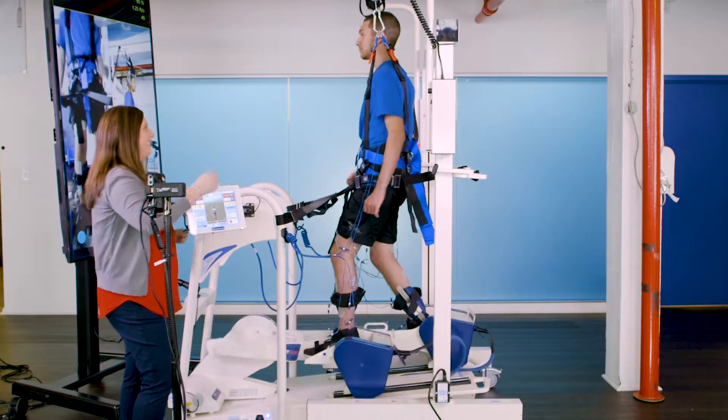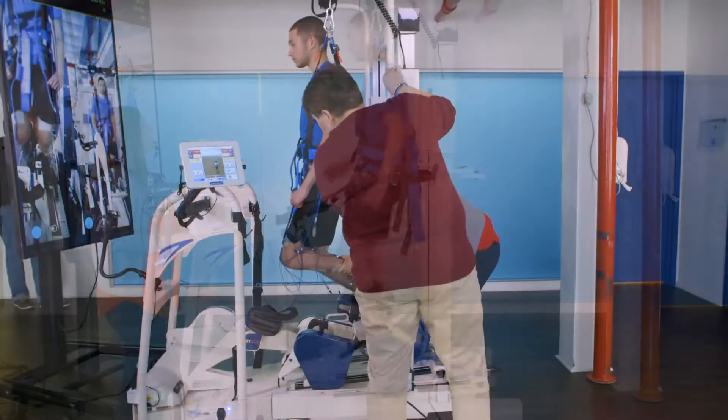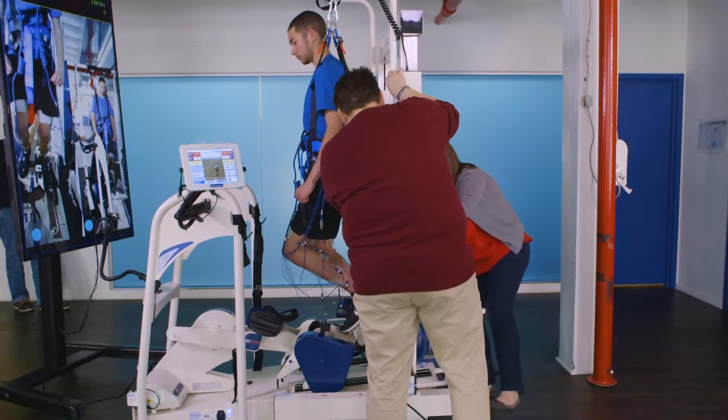This therapy can be conducted by a single clinician after two people have placed the patient in the system. The RT600 is a dependable mobile system which requires minimal clinic space, only requiring a standard eight-foot ceiling.